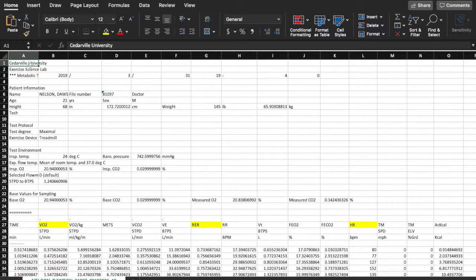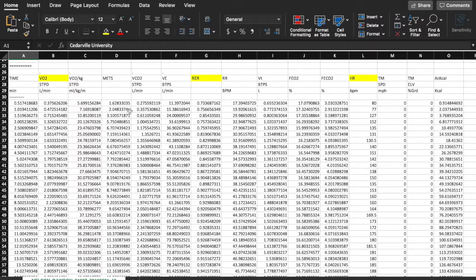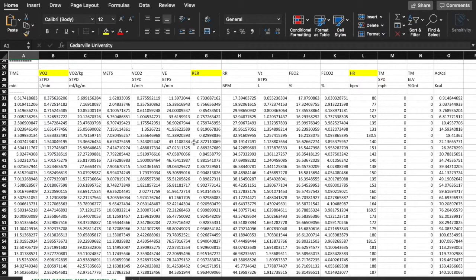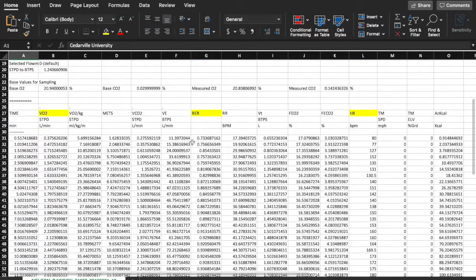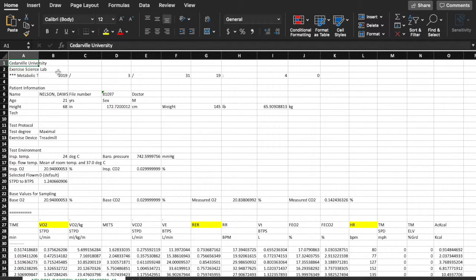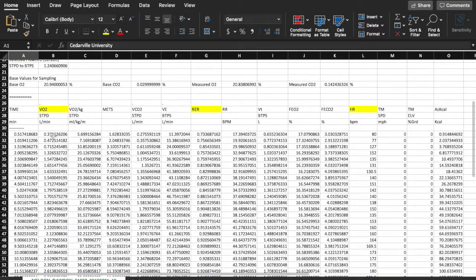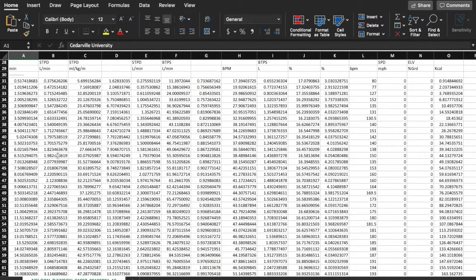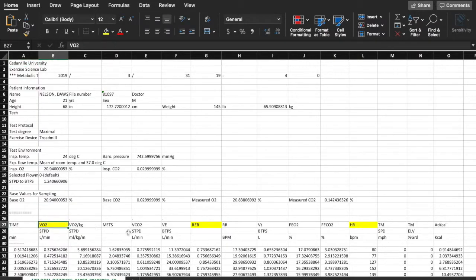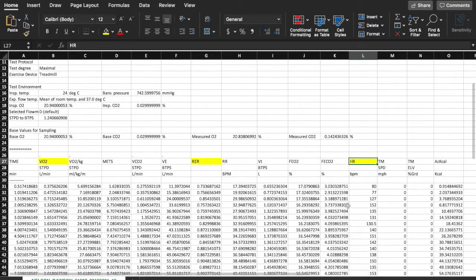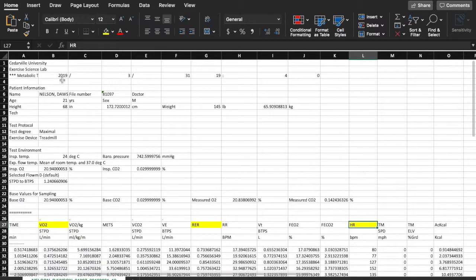Hey guys, my name is Kevin. Today I'm going to be running you through some metabolic data that we got from a VO2 max test we did on Dawson. This is what the data would look like outputted from the Parvo TrueOne metabolic cart in the Excel format. The Excel format is the most practical way to get the data because it's very easy to compare numbers to other trials or do graphs. I'm going to talk about the three main key data points you'll see in a lot of studies, and also go over the other ones quickly.